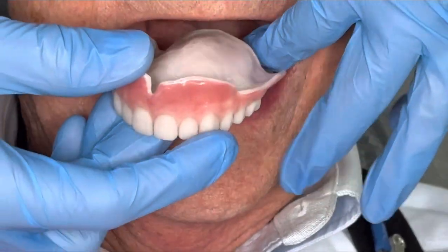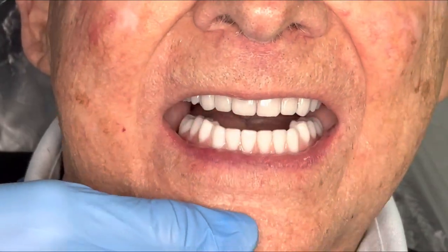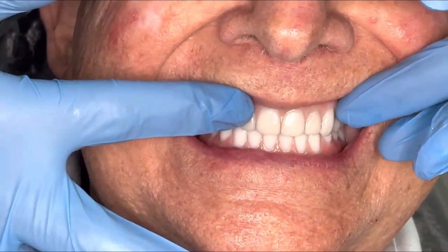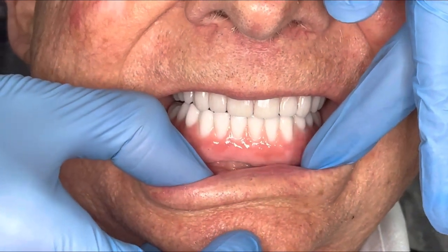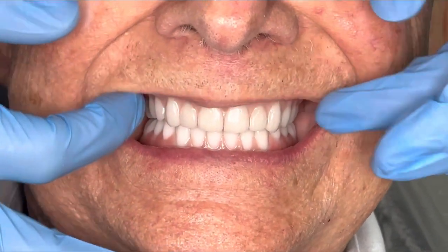And then here we go, just the upper. You're gonna bite together for me, smile really big. So there you go, combination of milled teeth, printed teeth, all 3D designed together, along with a custom milled bar. And so we should have a nice solid restoration that should last. Very good, thank you.